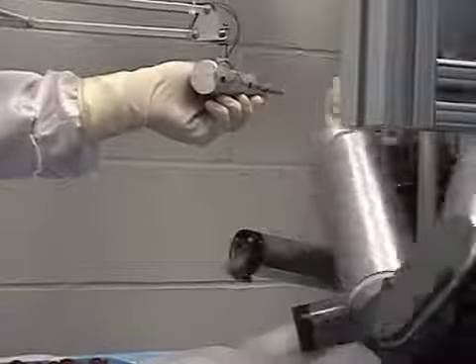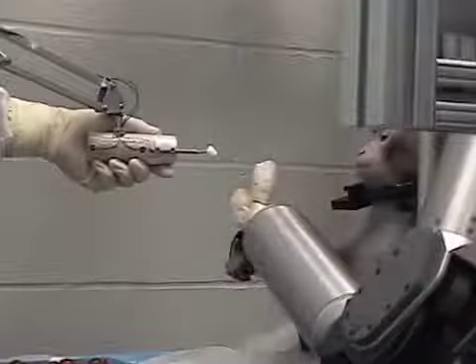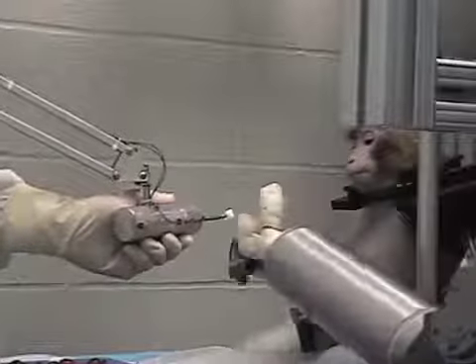A multi-electrode array implanted in the monkey's motor cortex records the spike pattern of 116 single neurons. The movement intent signals generated by this population of neurons are decoded by a computer in real time and then executed by the robotic arm.